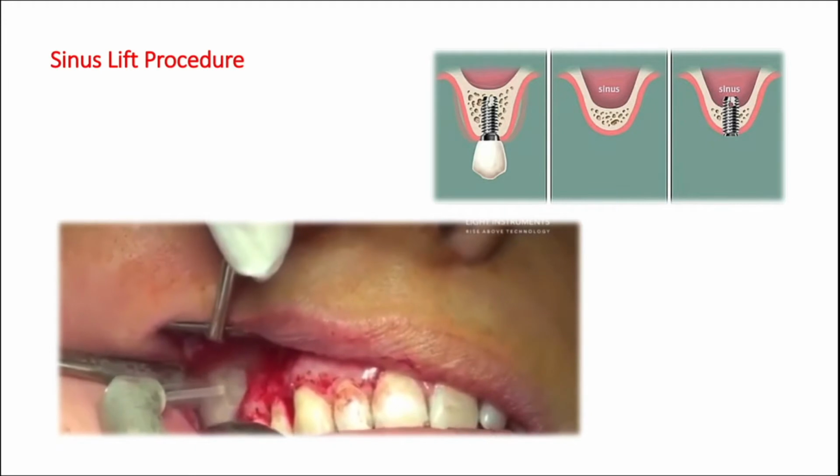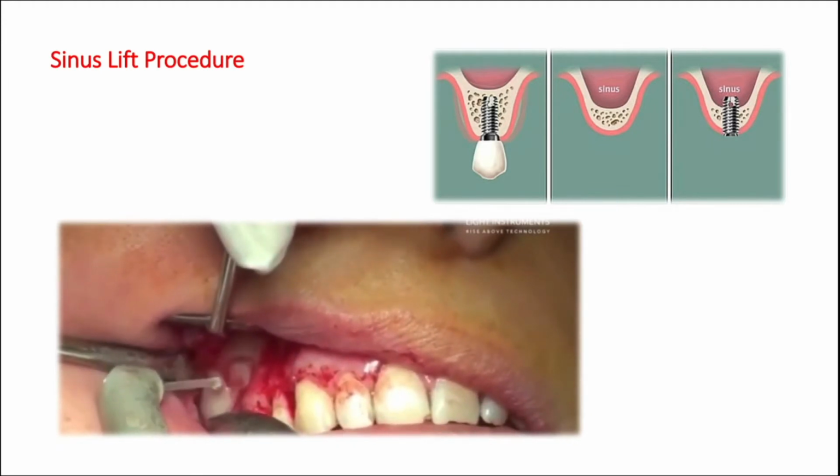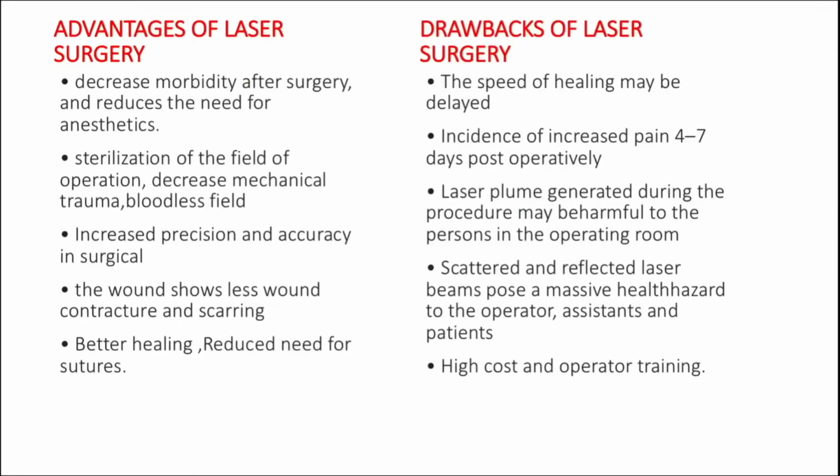Lasers can be used in the sinus lift procedure. The procedure can be done by making a lateral osteotomy with a decreased risk of perforating the sinus membrane, and after surgery it reduces the need for anesthesia. Sterilization of the field and a bloodless field decrease trauma and increase accuracy in surgery, and the wound shows less contraction and scarring, better healing and reduced need for sutures.